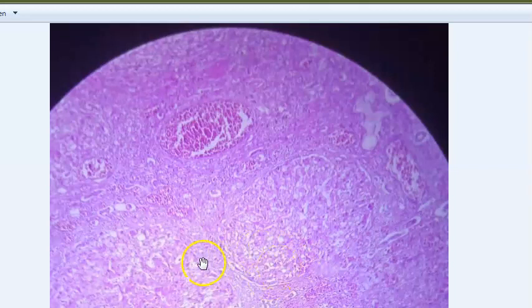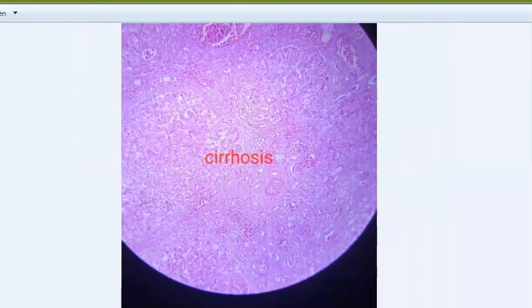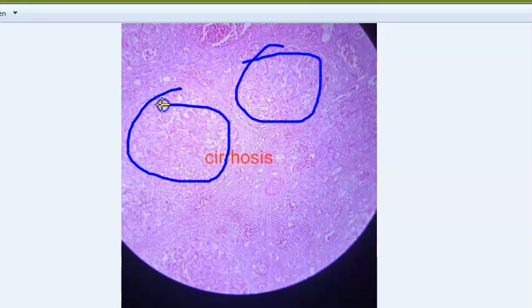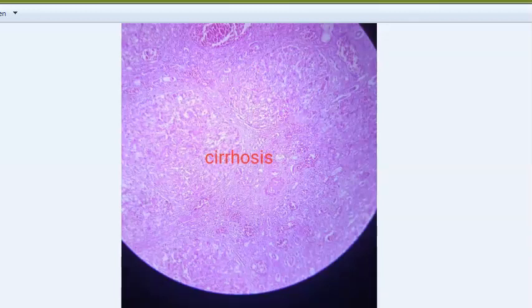Zooming in, you can clearly see septa and a nodular appearance - this is cirrhosis of the liver. Fibrous septa divide the hepatic parenchyma into nodules, causing distortion of lobular architecture. You will not be able to spot the central vein - the portal triad and central vein are not identifiable in regenerative nodules. Features include uniform-sized micronodules, fatty change, fibrous septa, and ductular proliferation. Complications include portal hypertension, hepatic encephalopathy, and hepatocellular carcinoma.